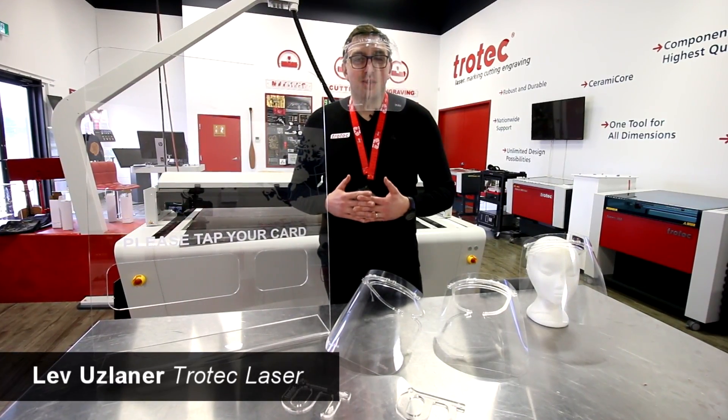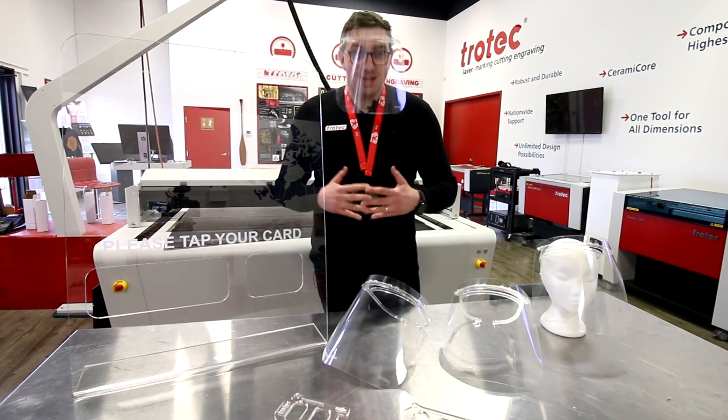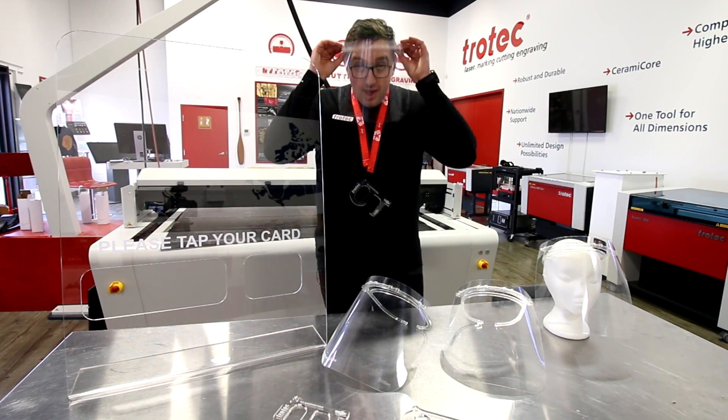Hey guys, it's Lev here with Trotec Laser. Today we're going to be making our personal protective equipment COVID-19 kits. So let's start with our headgear.